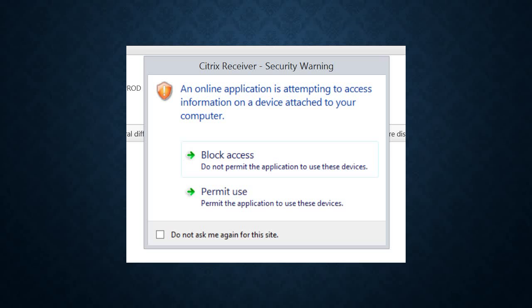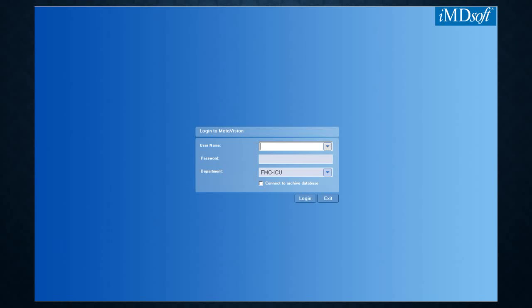If you get any certificate or security warnings, just click Permit Use or Accept Certificate to allow the login to continue. Once that's complete, MetaVision will start up and you'll see the blue screen where you can enter your username and password and select the proper unit you're working in or want to view patients in.